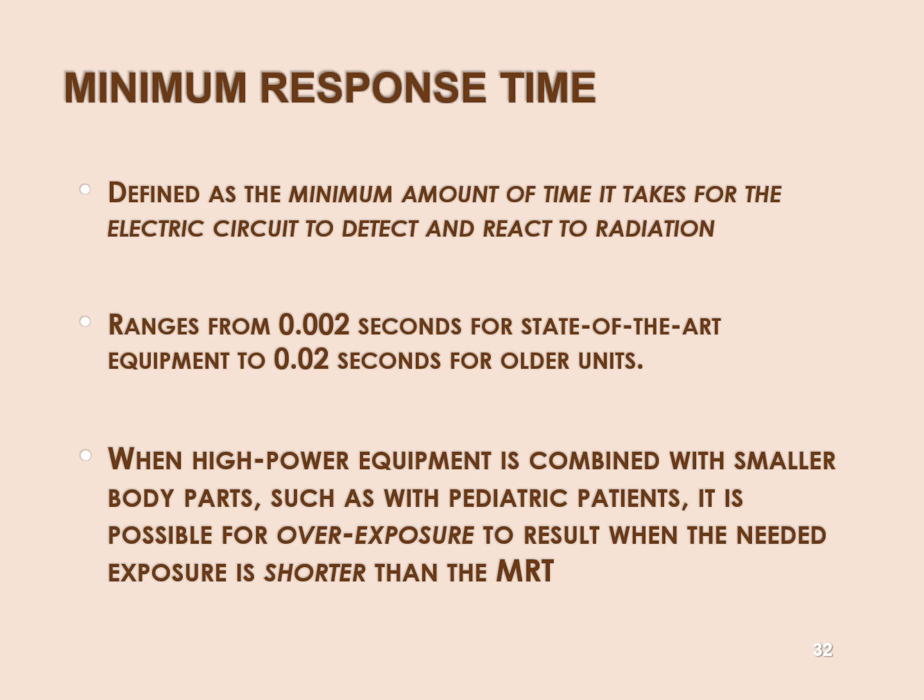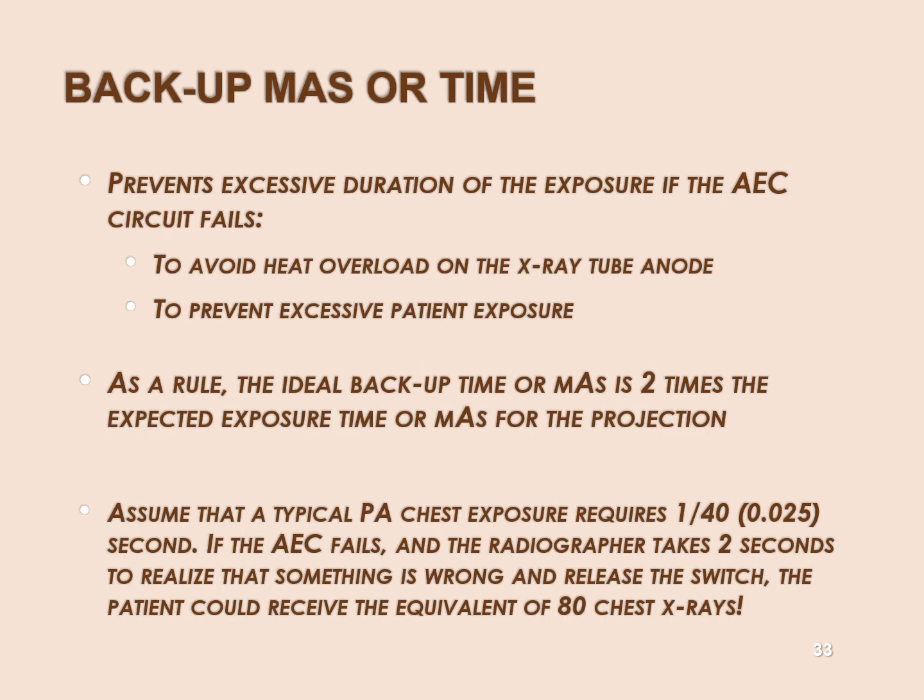That's problematic. You're giving 10 times the dose. Okay, so the backup timer does two things. Okay, so minimum response time is the idea that sometimes it's appropriate to use manual technique because your AEC can't turn off fast enough.